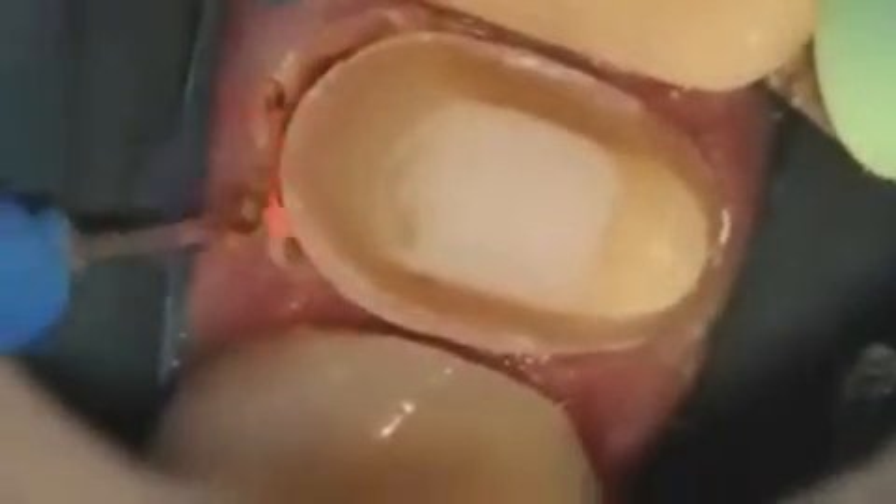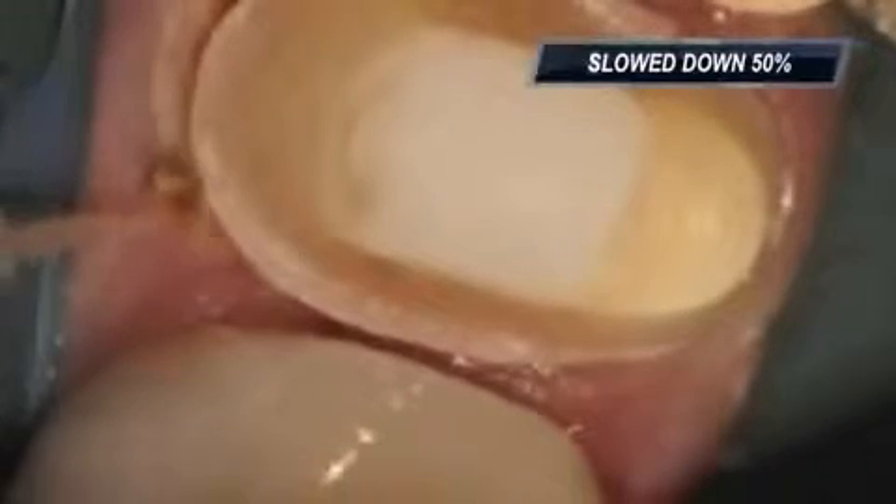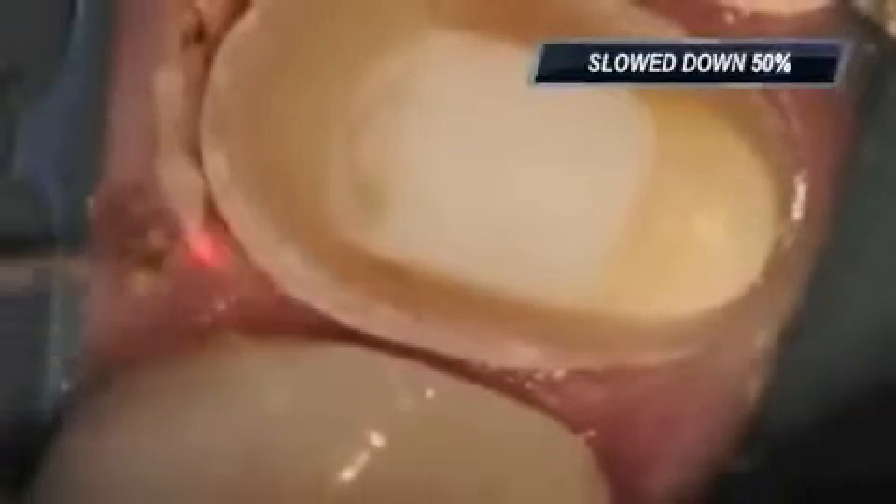I want to show this in a little bit greater detail. Here it is in slow motion, and you can see there is some debris building up on the tip. You're not trying to go more than half to one millimeter into the sulcus — short back and forth brush strokes. Again, look at the angulation of the laser, and you can see how the trough is created.